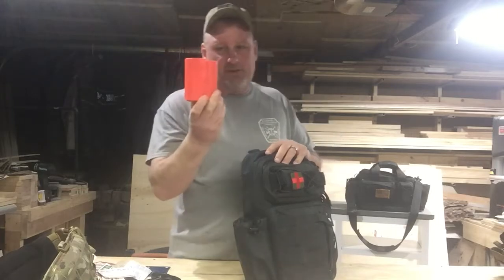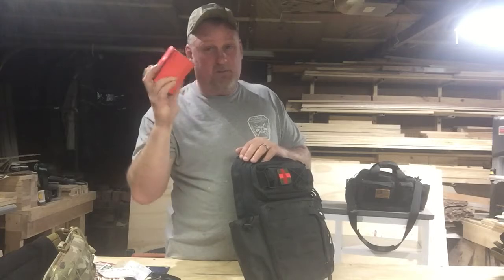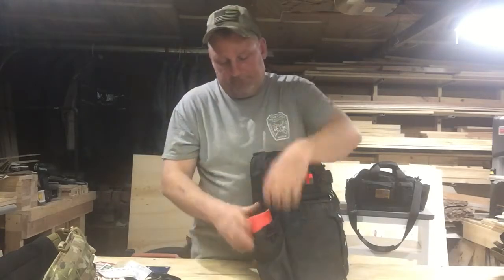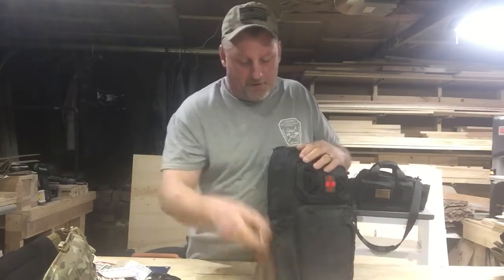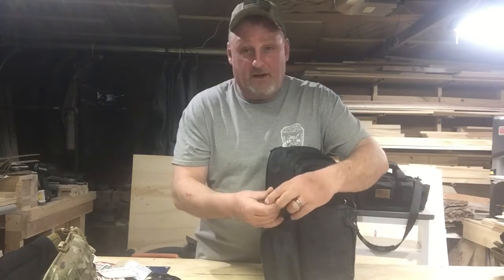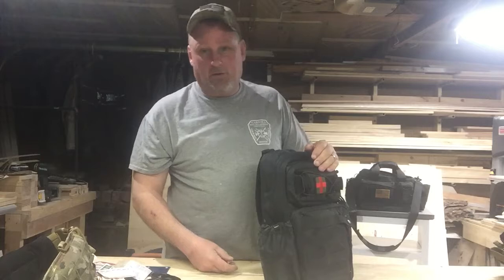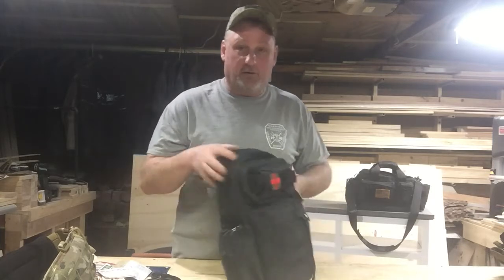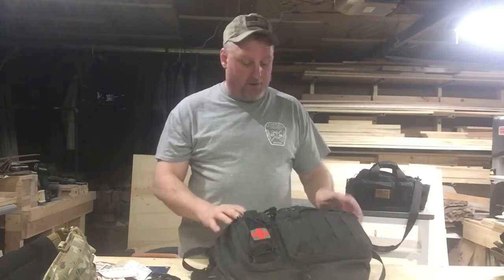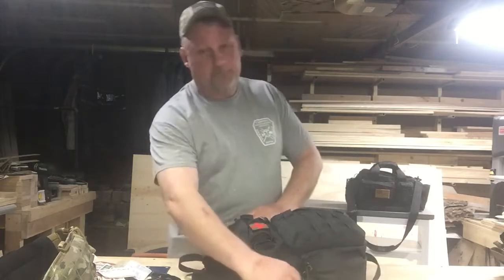And then a SAM splint. These are lightweight, inexpensive, about $5. You can splint basically every bone in the human body with one of these. Okay? So they're easy to carry, don't cost you a lot, and can really save you on complications if you can protect that bone, that arm, that leg, that ankle, till you can get to more advanced medical help. You'll have less injury, take less to fix it, and you'll have a better outcome, better recovery. Okay? So now we'll get into the main pocket.